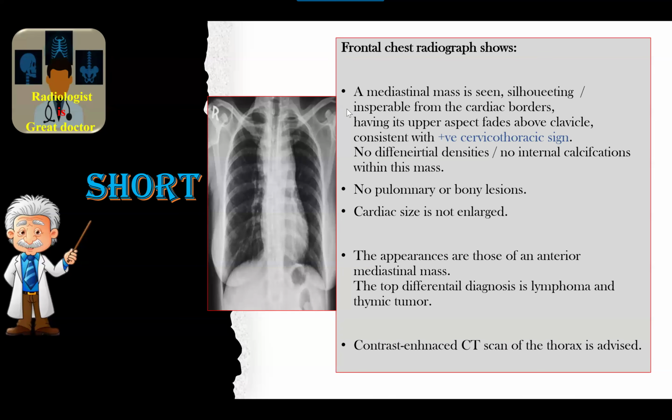So at first, take just 1 minute or less to comment on the film and to collect everything about this radiograph. We have 25 radiographs in the exam for about 2 hours, so every radiograph takes 4 to 5 minutes. Some radiographs will take only 3 minutes, and others may necessitate more than 5 minutes. You have to do time management by training at home first. At home, we should revise every diagnosis and the next step.